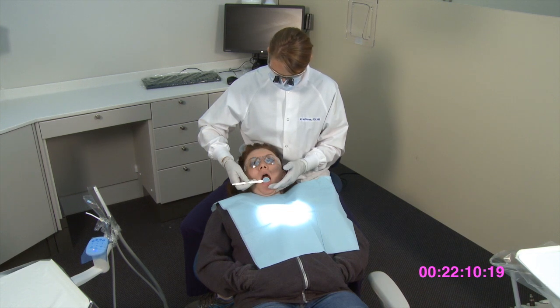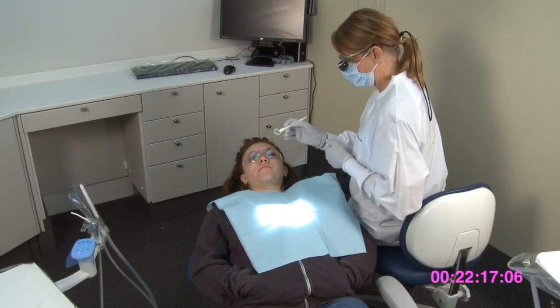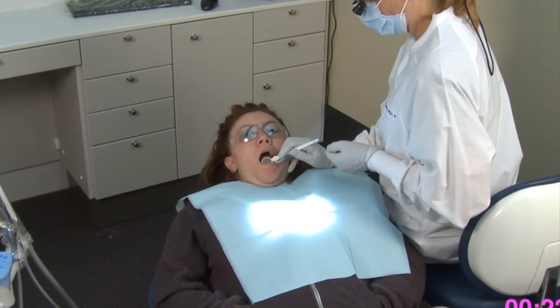For the mandibular anterior lingual surfaces towards, the mirror fulcrum is on the left premolars, and the patient's head is in neutral with the chin down. The clinician will sit at 4 o'clock.